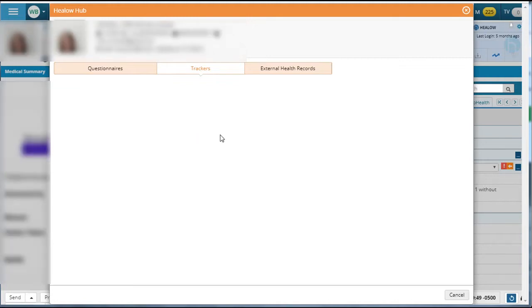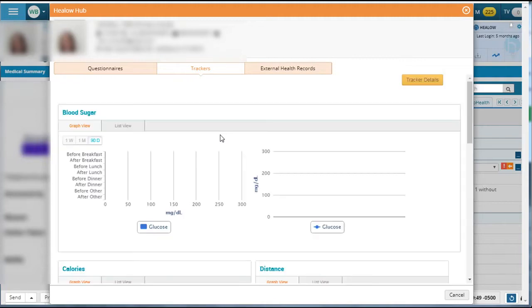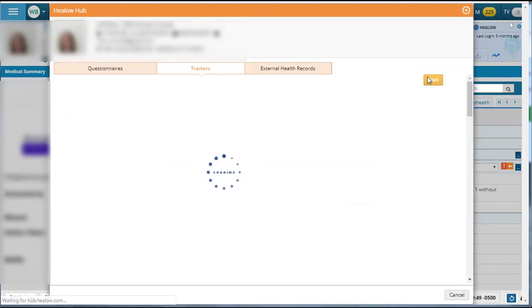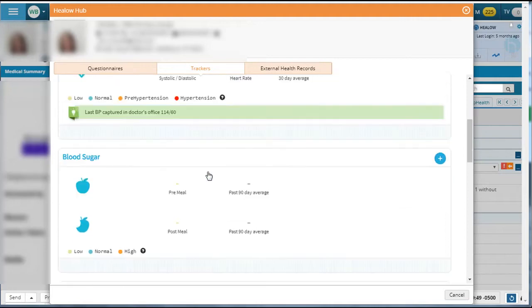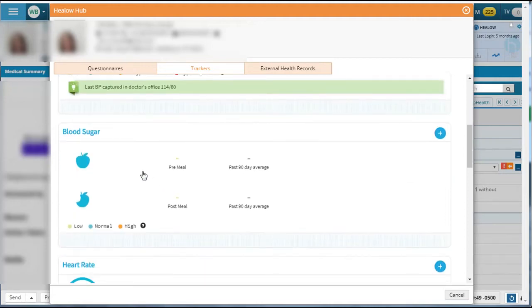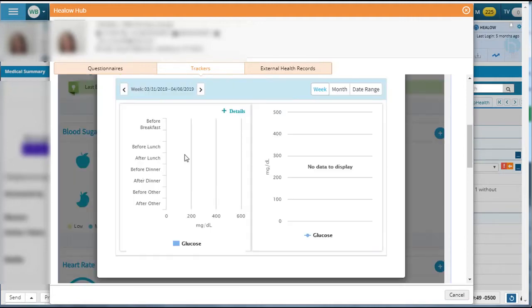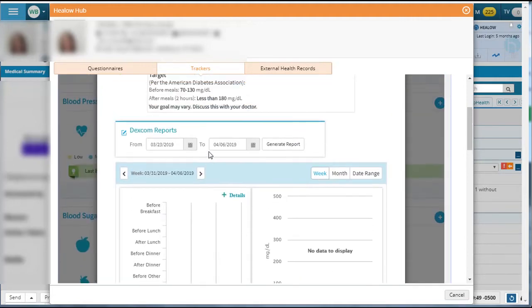Once it does, again you'll see an orange button in the upper right that says tracker details. Click on that. Scroll down to find blood sugar and click within the box that says blood sugar.